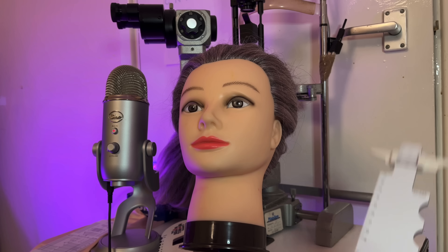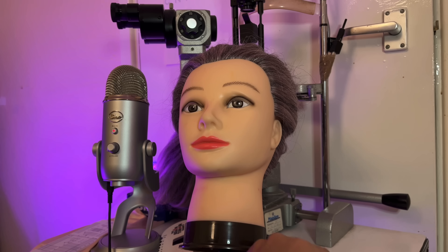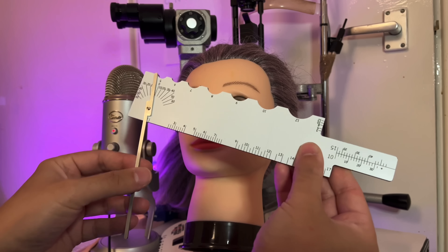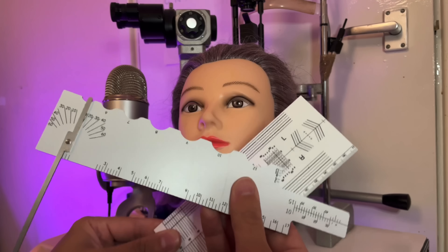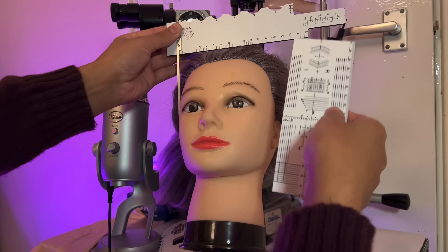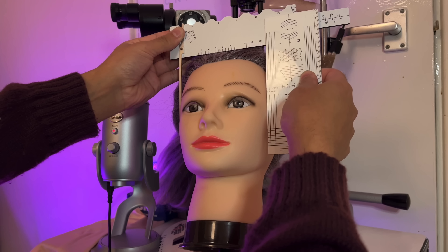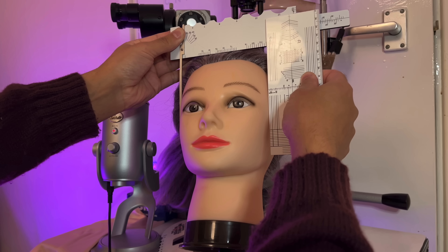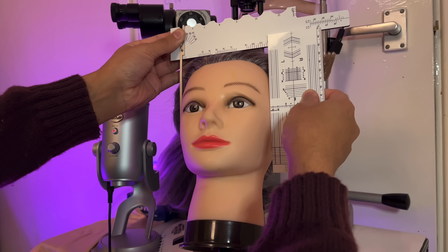Let's move on to some technical measurements. I'm going to use this measuring tool in conjunction with the ruler here. I'm going to try head width — you want to be positioned like this — and we're reading off the top scale. That is head width.